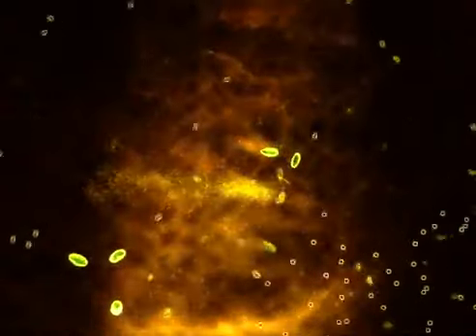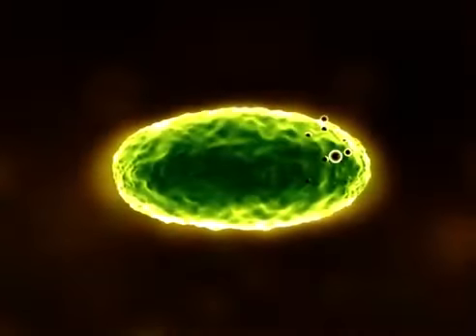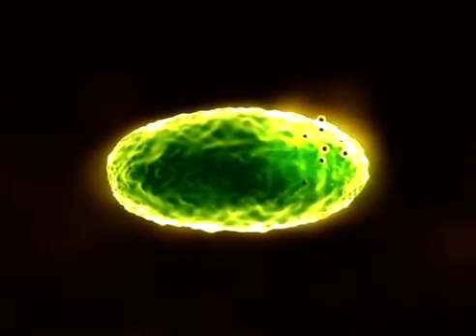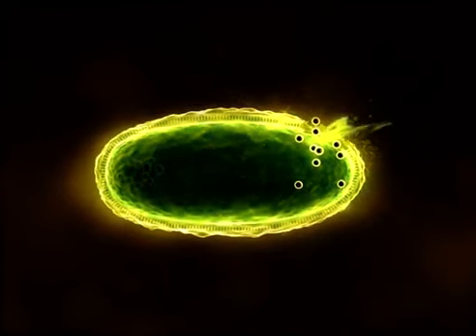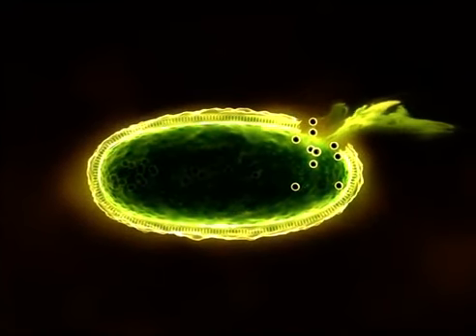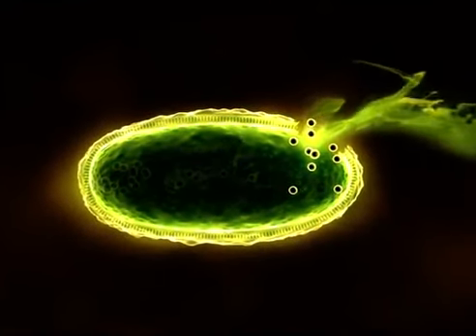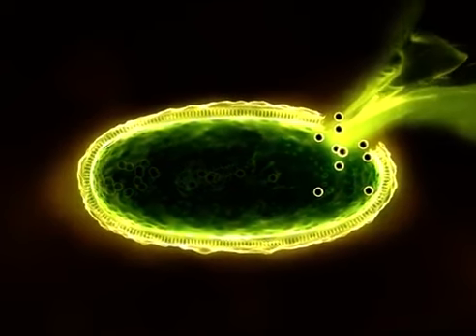The antimicrobial mode of action of silver can be explained in three ways. First of all, cell wall rupture. When AG+ binds to proteins in the cell wall, the wall could break and the contents of the cell could leak out, resulting in the death of the bacterial cell.